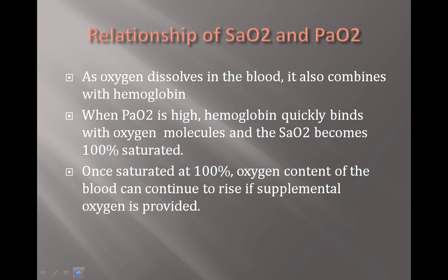This is appropriate for immediate peri-intubation stabilization, but as clinicians, we need to understand that if we are providing supplemental oxygen for our patients, SATs over 95 may indicate that we are over-oxygenating, and we should feel compelled to reduce the supplemental oxygen in line with our treatment goals. So, reassurance is good, but more isn't necessarily better.